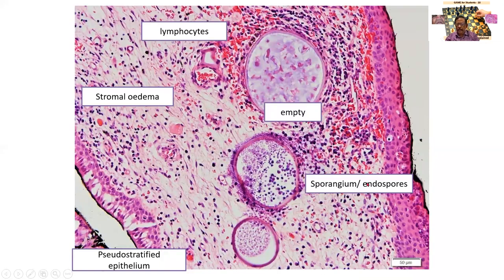This is another picture. As I told you earlier, here I am finding some clear cells, the goblet cells, and the pseudostratified columnar epithelium. At the other end, it is getting replaced into a squamous-like epithelium. This is called transitional. The stroma here is edematous. Edema means separation of the cells, and it is infiltrated with dispersed lymphocytes.